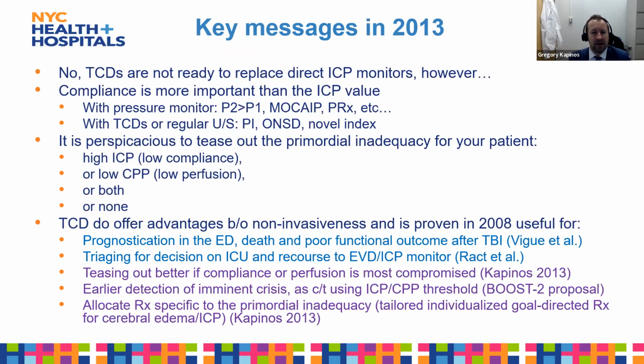So what were my key messages? They have not changed, actually. In 2013, when I was learning how to do TCDs on TBI and other patients that did not have a probe in the brain measuring the ICP, I was trying to send those messages through all those different presentations nationwide. Of course, when I speak to neurosurgeons, I'm always starting by saying, don't worry, I'm not going to try to convince you that TCDs will replace anytime soon an ICP monitor, whether it's parenchymal or ventricular. However, I want to shine some light on the fact that there's a body of knowledge that you can gain, that ICP is not the holy grail. It's not the end for all of better management of mass effect in the brain.